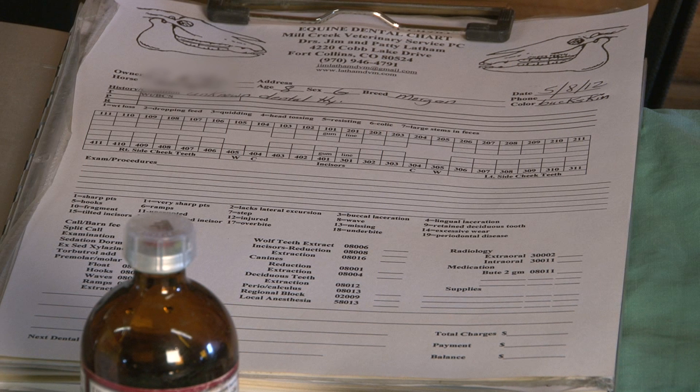Also, everything that you see and do will be charted, and this is just an example of a chart that we use. There are many different forms — you're going to find one that works well for you.